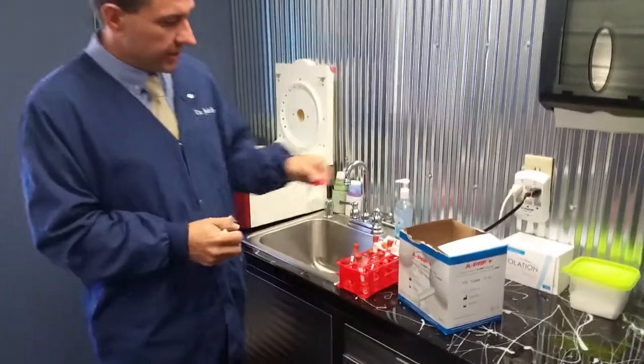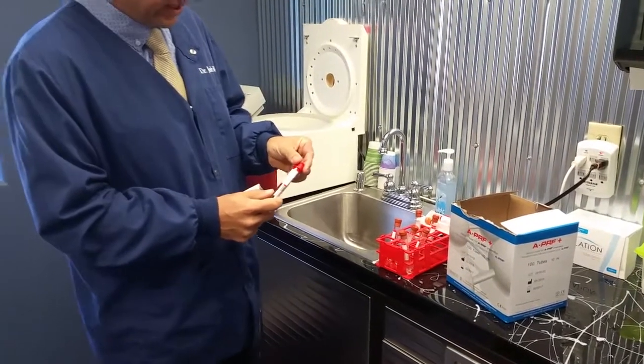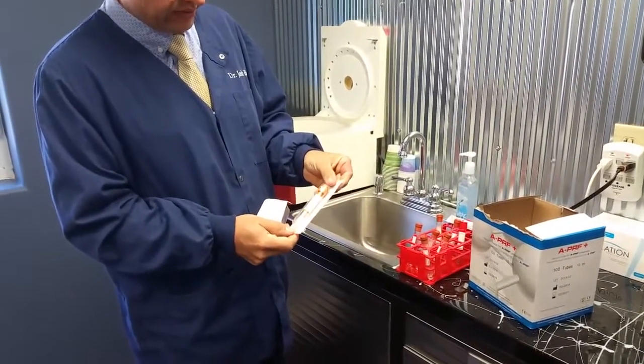If you look at the tubes, Dr. Schockern has a red tube, and this is the regular advanced platelet-rich fibrin which he basically brought to us here in the States and France. And then he's got an orange tube for injectable platelet-rich fibrin.